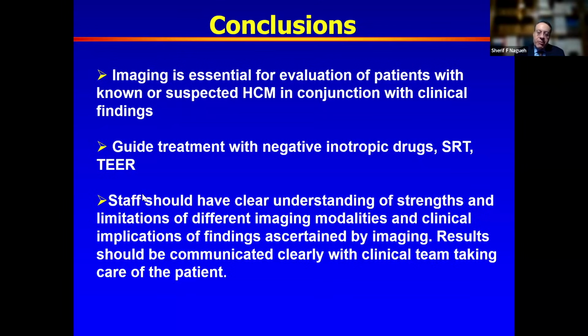Some patients will be able to do it, so we want to continue with that. If somebody is short of breath and not able to do it, maybe they rest and you resume again. I tend to be guided by the rest gradient, and I want to see a value higher than that as opposed to identical values.